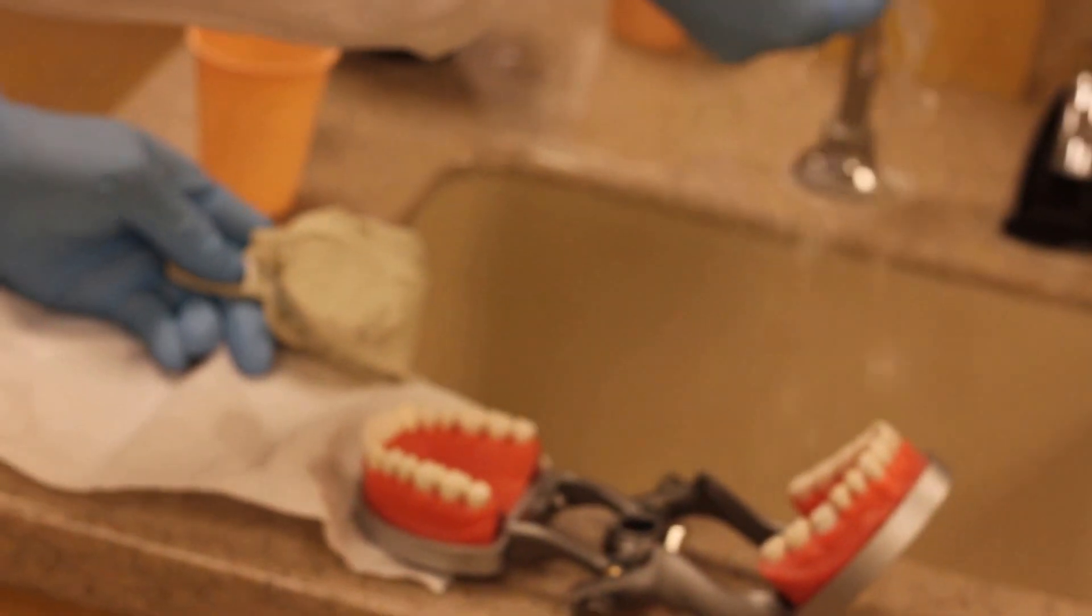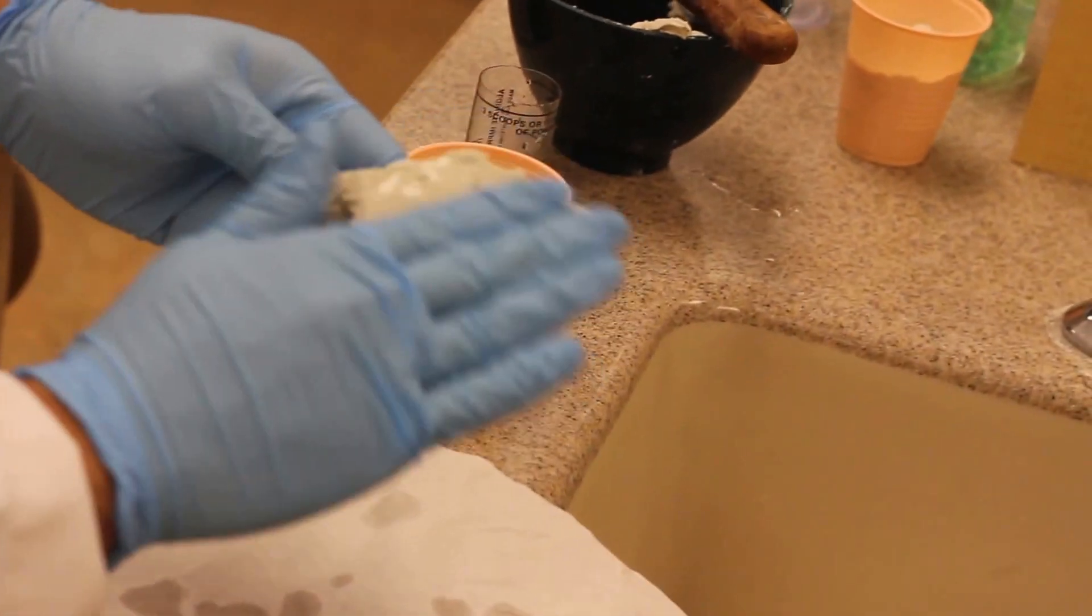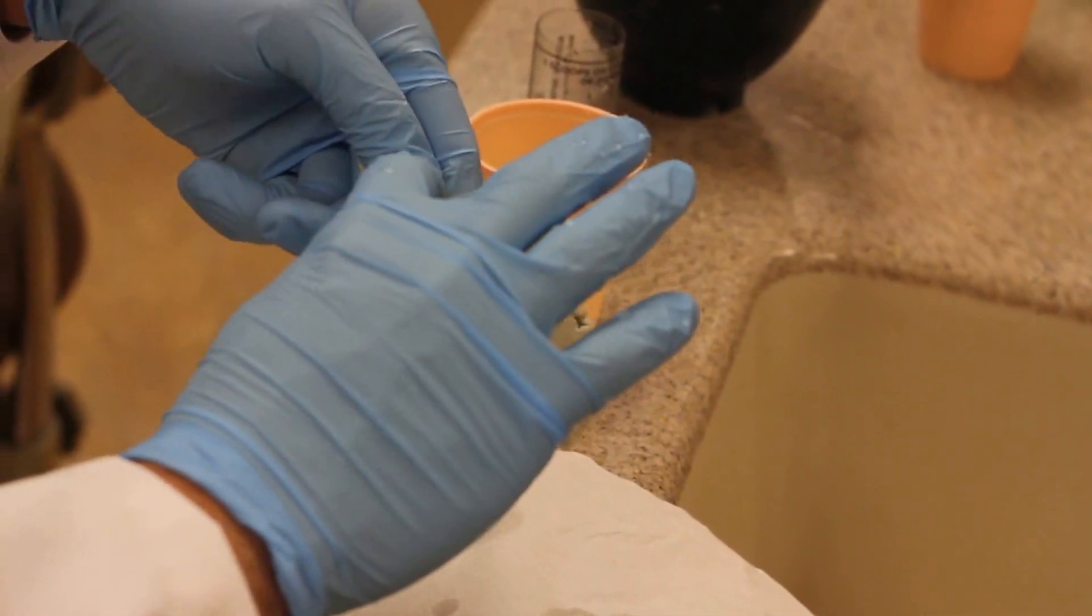And what I like to do sometimes is wet my fingers a little bit and then kind of smooth things out and then remove some of the excess.